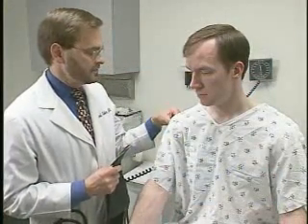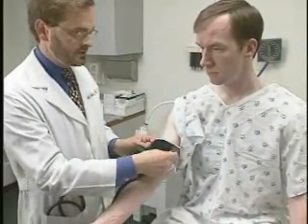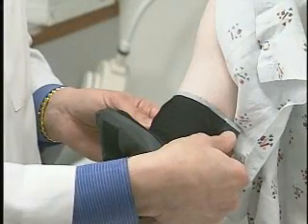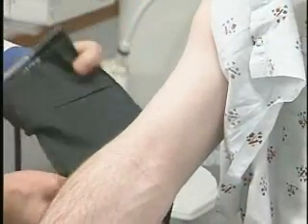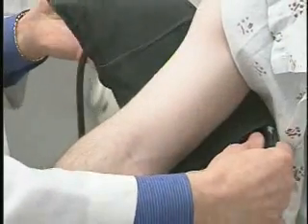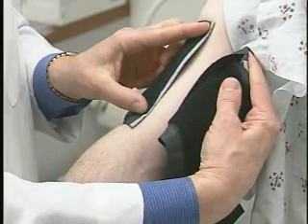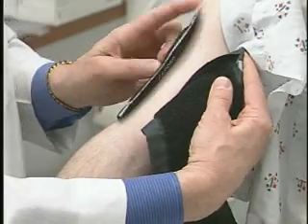To determine which cuff is appropriate, we need to measure 2 different variables on the arm. We measure the width of the blood pressure cuff against the patient's arm. The width of the blood pressure cuff should be approximately 40% of the circumference of the arm. Also, determine the total length of the bladder of the blood pressure cuff, which is where the tubes come out of the blood pressure cuff. When you wrap the blood pressure cuff around the patient's arm, it should approximately be at least 80% of the circumference of the arm.